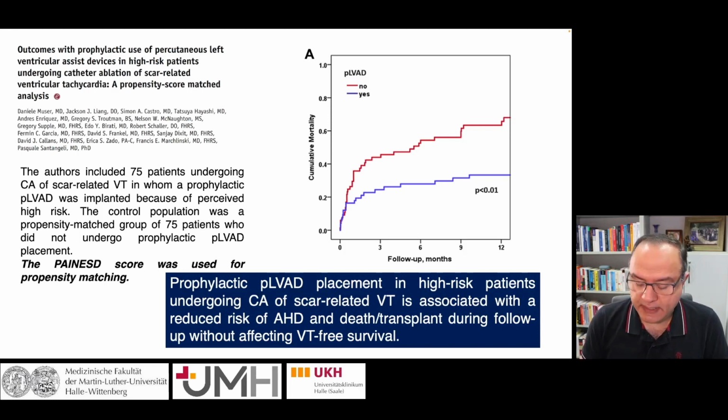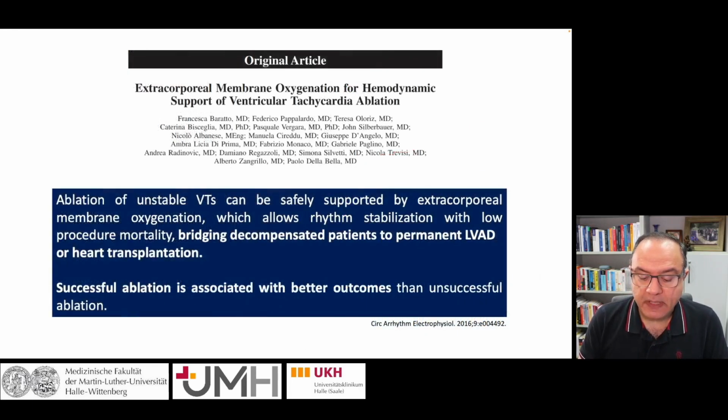in a prophylactic manner. One of the most important things is, except for percutaneous left ventricular assist devices, we can also use ECMO, extracorporeal membrane oxygenation, for hemodynamic support. And this study, also from Paolo Della Bella's group, showed clear positive effects of hemodynamic support in these patients.